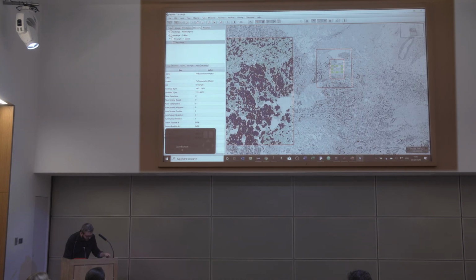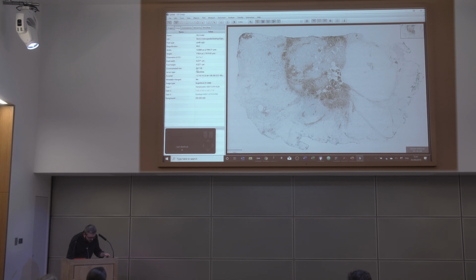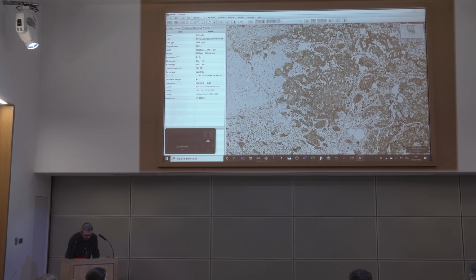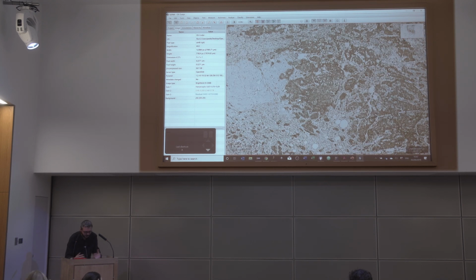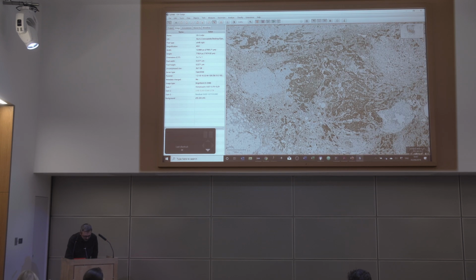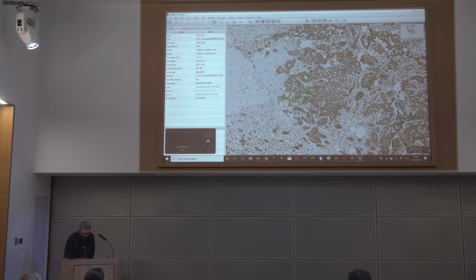So if I switch back again to QuPath, and if I go to a very simple image, you can see the entire image is about 26 gigabytes or thereabouts. And let's say we want to be able to identify the brown stained area within this. So don't worry too much about the classifications that I give it. I showed then the rectangle tool in QuPath, but there's actually far more powerful annotation tools. So here's a magic wand, tells me to select a region to begin. I'll choose another region here.